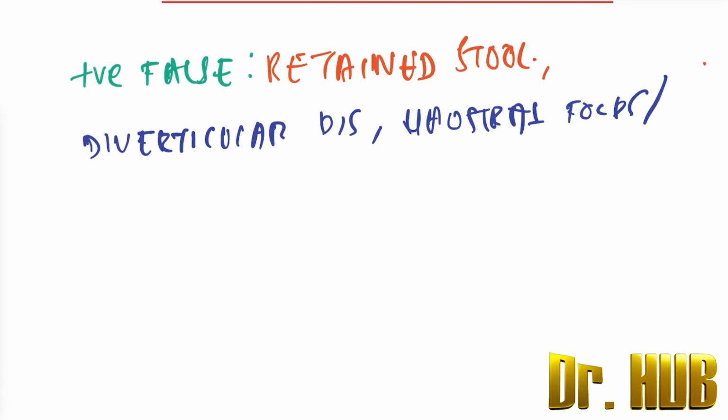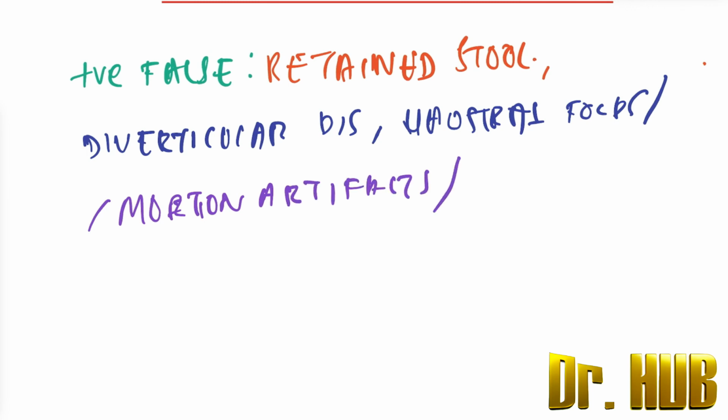Next there are motion artifacts and the inability to detect flat adenomas.